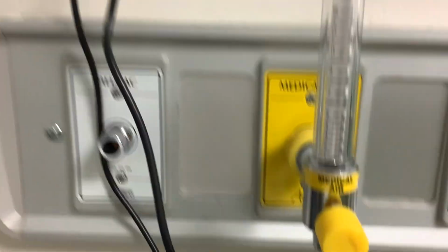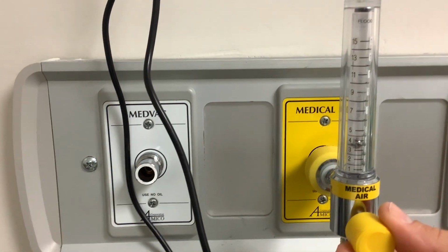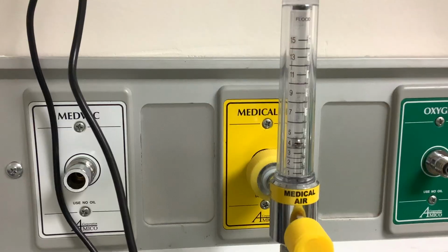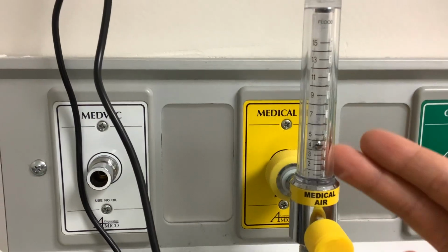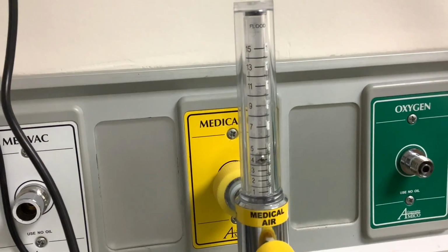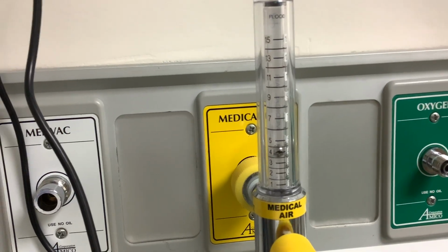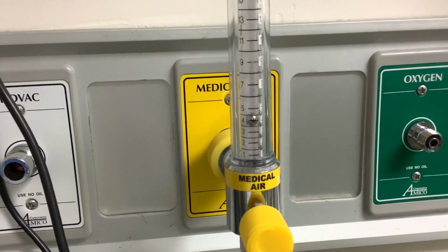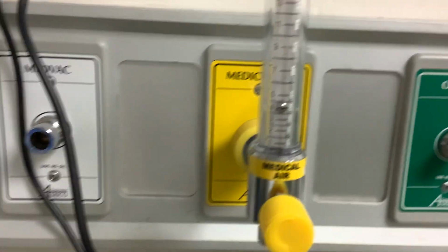So ultimately what occurs is, let's assume that I'm providing supplemental flow to this patient at 4 liters per minute. If the oxygen tubing that's attached to that were to get kinked and it's not pressure compensated, it would continue to read four liters per minute, and I may not be able to realize that maybe the hospital bed or what have you is sitting on that oxygen tubing and no longer allowing flow to go to the patient. And I know that I'm looking at a medical air flow meter. It's easier for me to get to that right now, but this is all applicable for an oxygen flow meter.